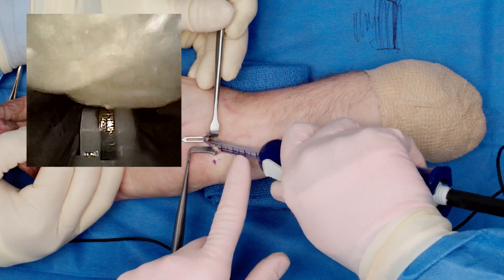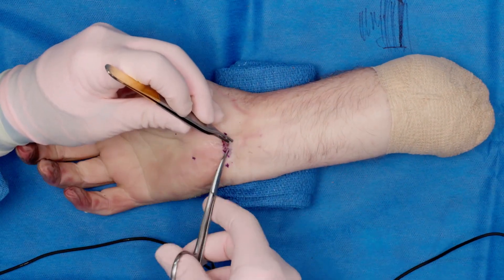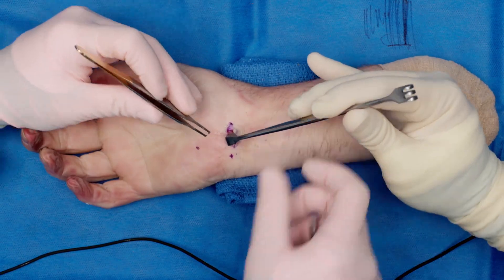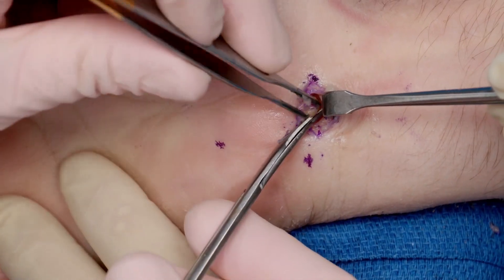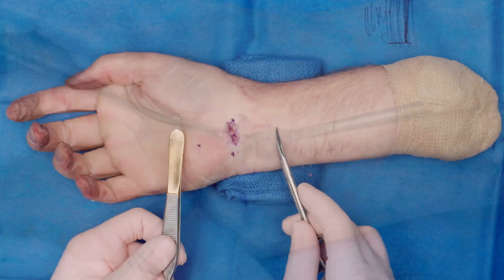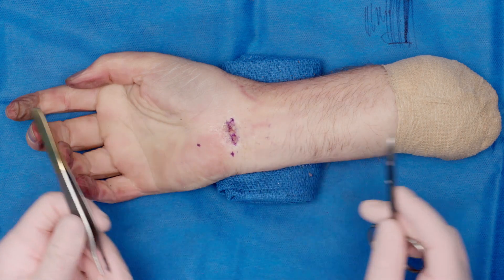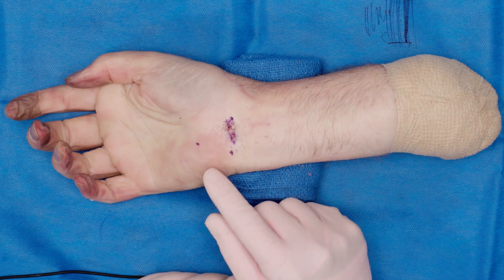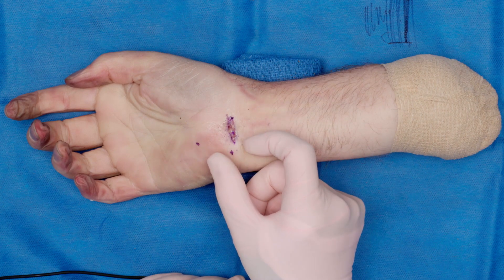Once that release is done, I take all my retractors out. I then use my assistant to hold the skin on the proximal portion, and from here I can release the antebrachial fascia. You can easily see this in view — I do not push my scissors; I want to see the entire way and see the fascia as I release it. At the end of that release, I'm confident I've released not only the carpal tunnel but the antebrachial fascia as well. I rinse and close, typically using a 4-0 prolene where I make a knot on one end, run it, and make the second knot — you just snip one knot and pull it.